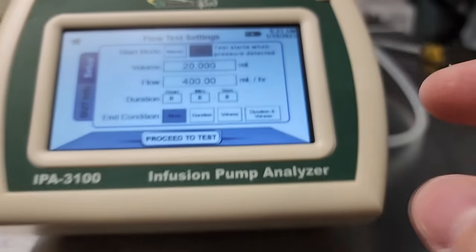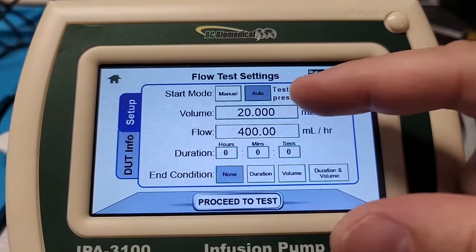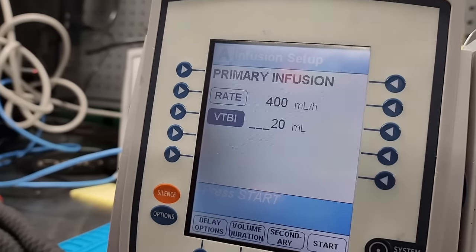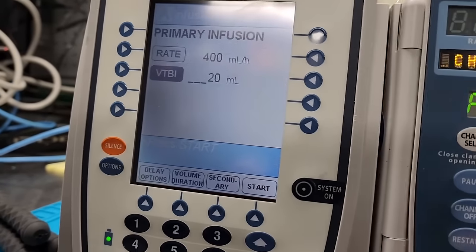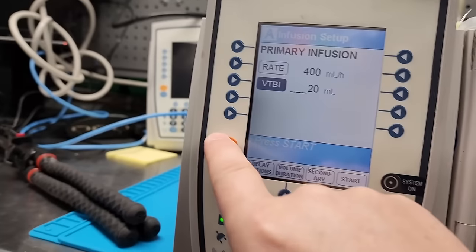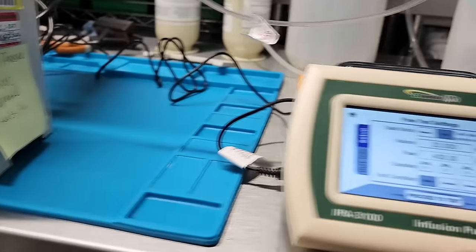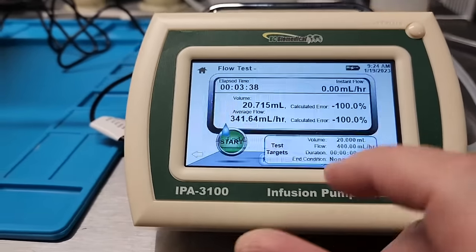Here we go. We are on flow test. It says to run it at 20 milliliters and 400 milliliters per hour. We have 400 milliliters per hour, 20 milliliters, and an alarm of course. So let's go ahead and proceed to the test.